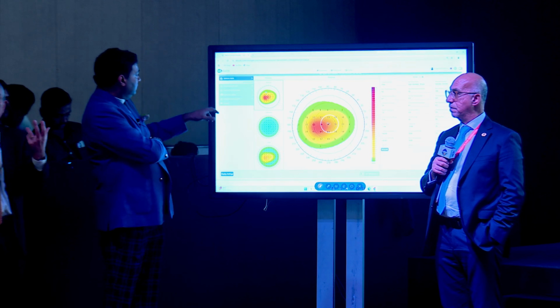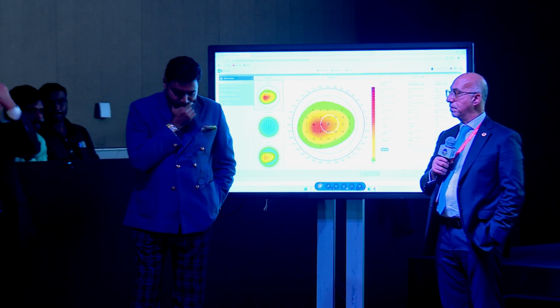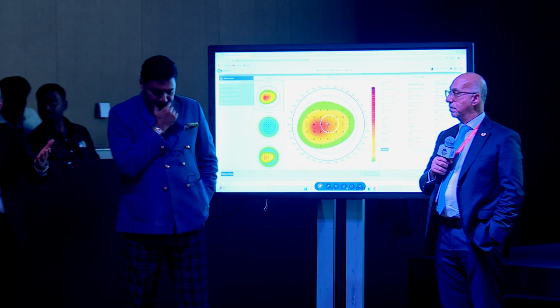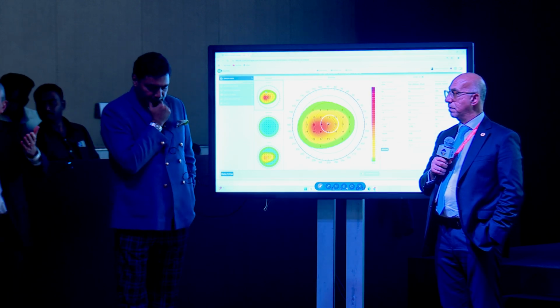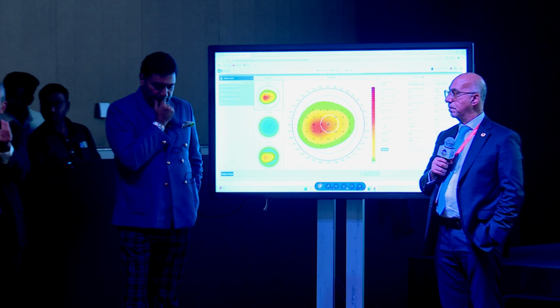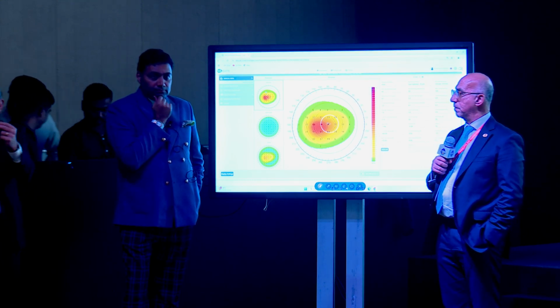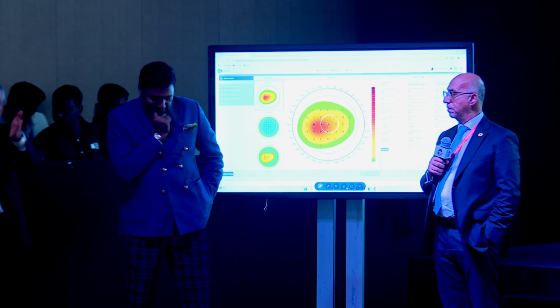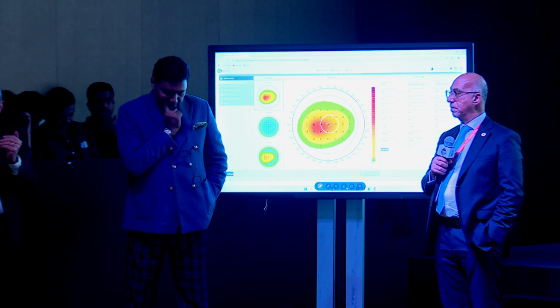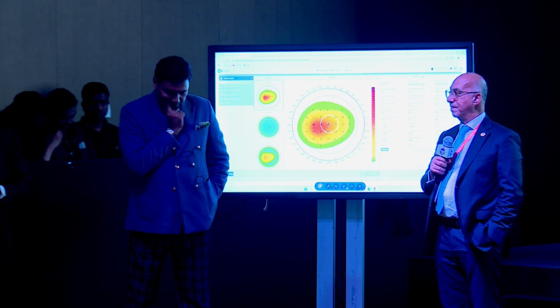If we make an optical zone of 7 millimeter, this will mean that we create, especially considering a hyperopic treatment. If we make hyperopic at 7, we will make a canyon. We will destroy basically the biomechanical properties of the cornea, and the epithelium must regrow in order to fill the canyon that we are creating.